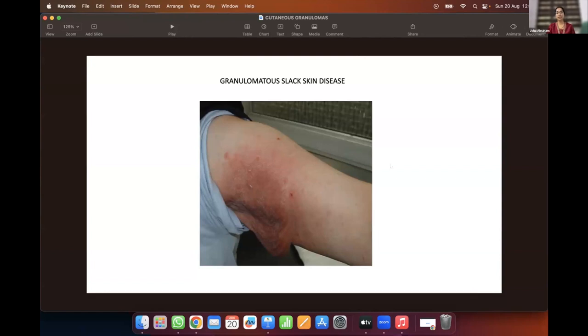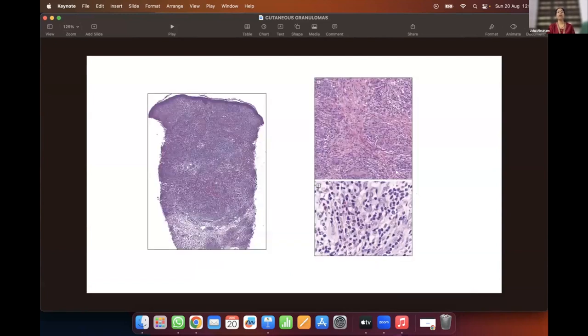So this is an indolent T-cell lymphoma. What do we see in this indolent T-cell lymphoma? If you look at this slide, you can see that the epidermis is markedly thinned out and you're seeing a diffuse infiltrate extending from the superficial dermis up to the deep dermis and even up to the subcutis. Then how do we differentiate this from normal lymphoid cells? You have to look carefully.